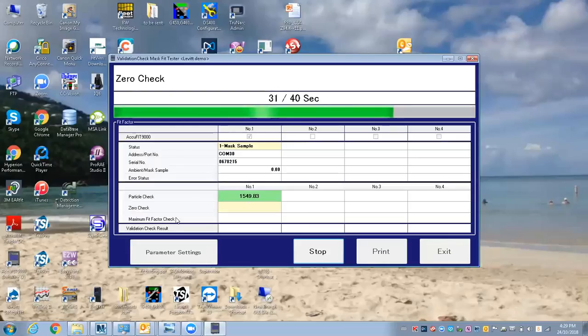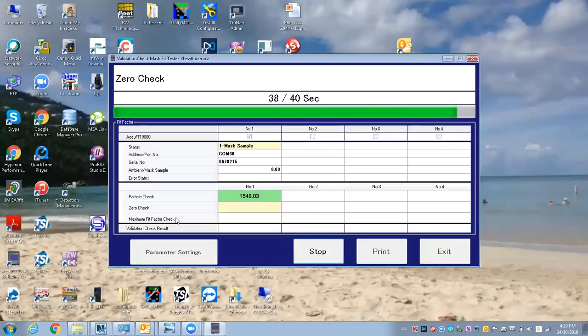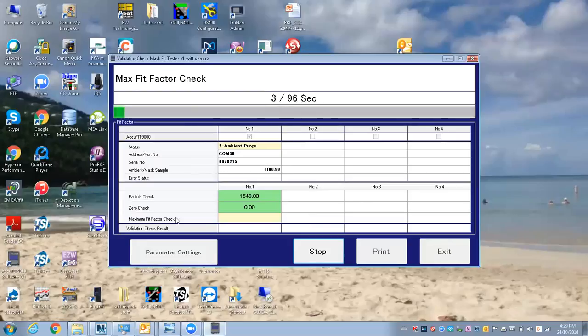This is good practice—to do your verification check each day. Maybe the alcohol has gone bad, so you may not get enough particles to do the testing.